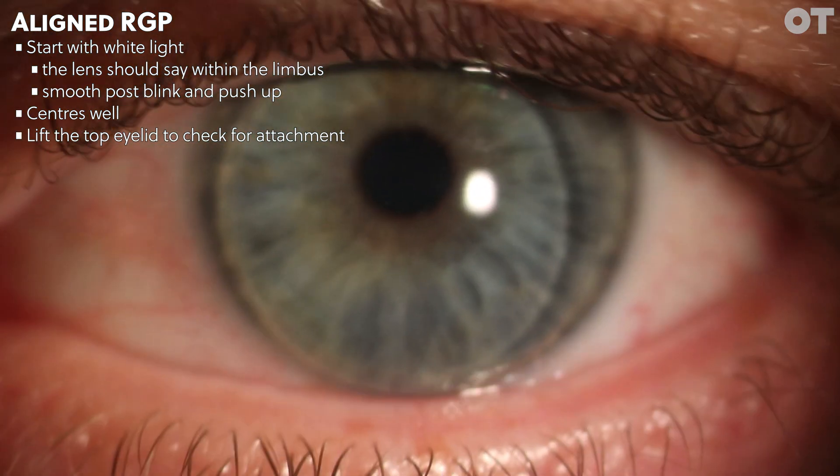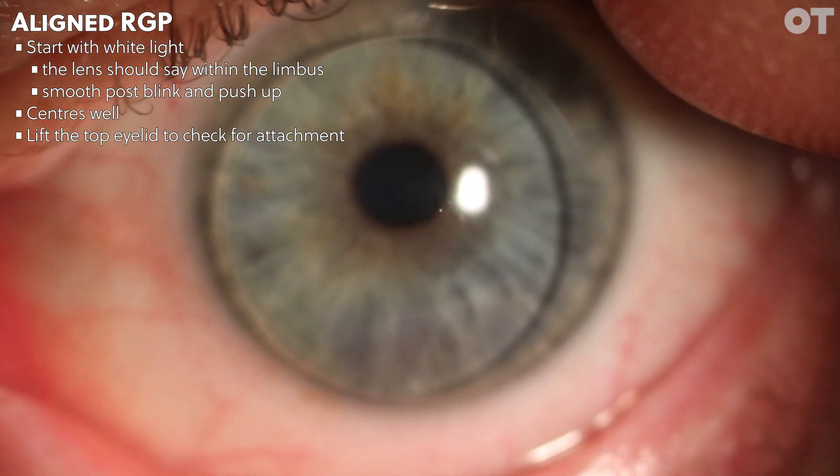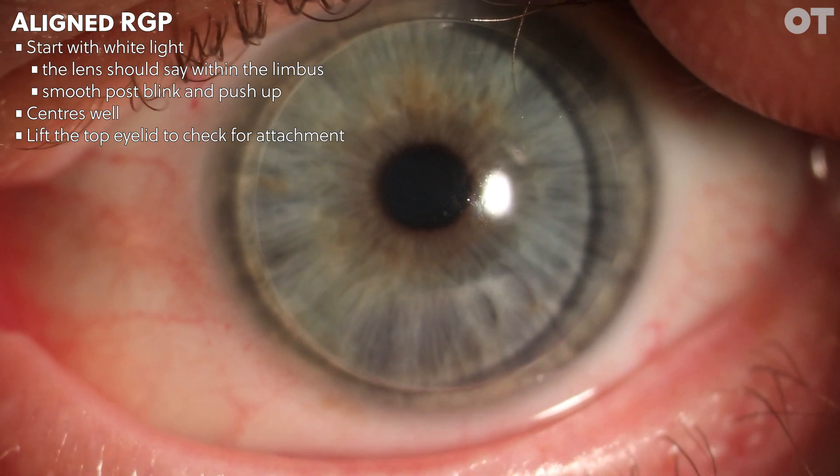It's a good idea to lift the top lid to look at the centration of the lens. Some lenses can be lid-attached, meaning the eyelid can drag the lens up, making the lens appear to be centred better than it actually is.